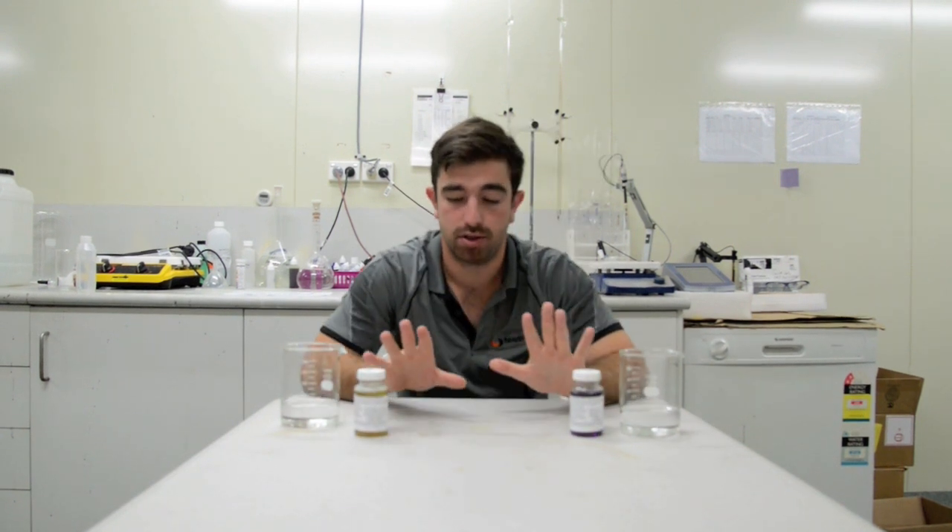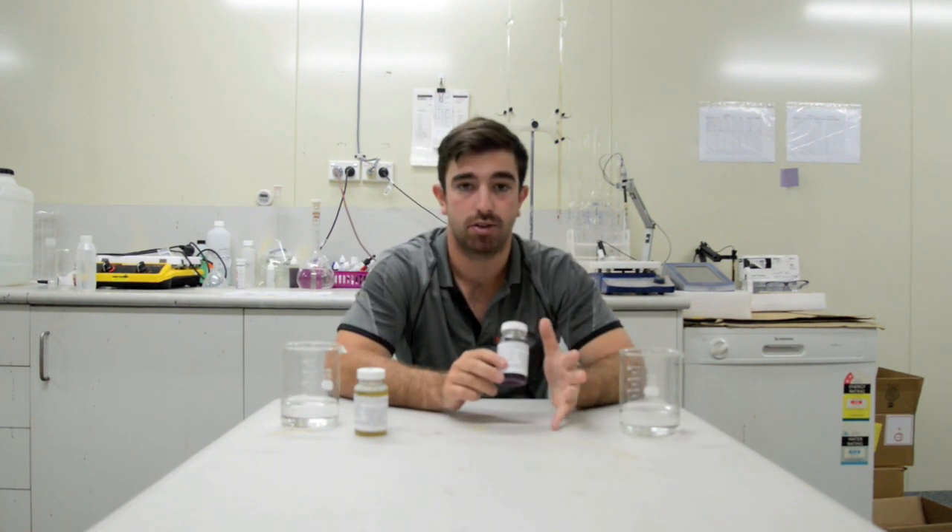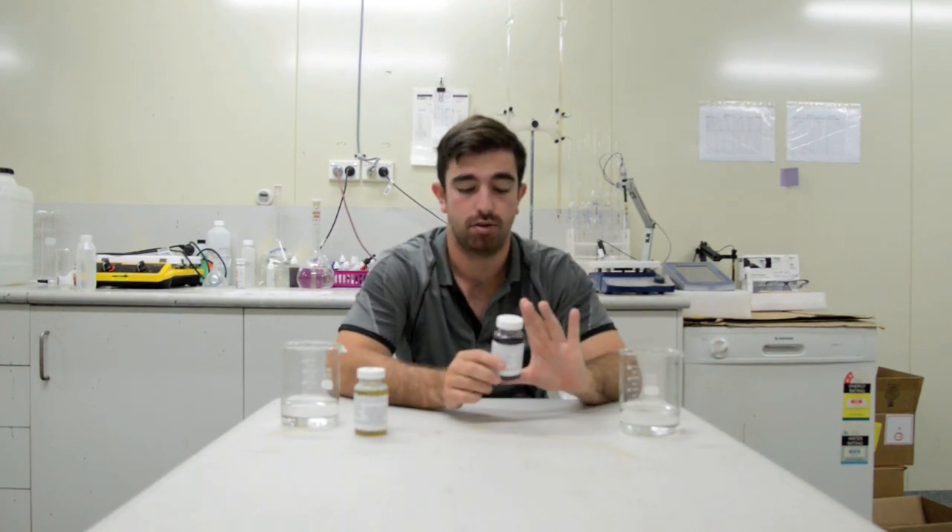To dispose of our jars — this one's quite simple. Just pour down the toilet, flush away, and throw the jar and the lid out.